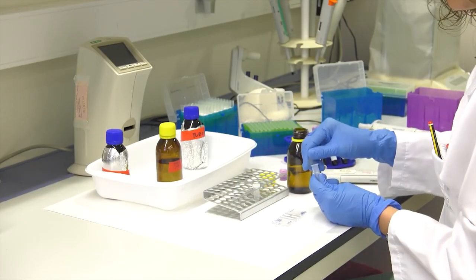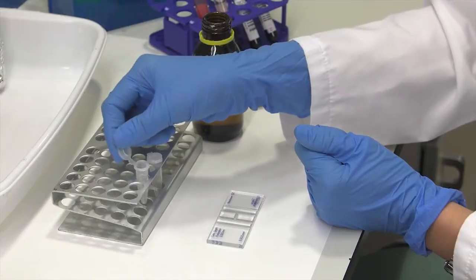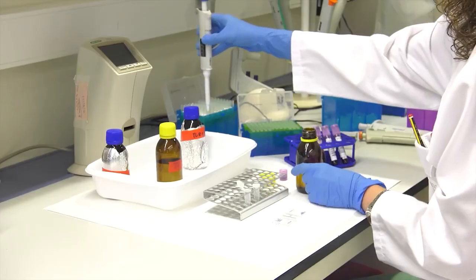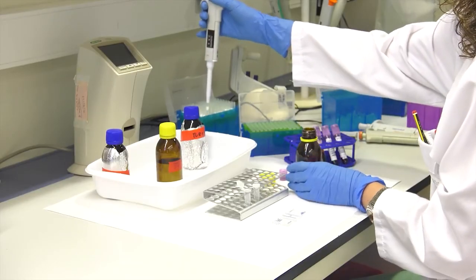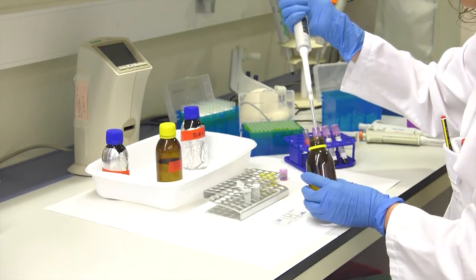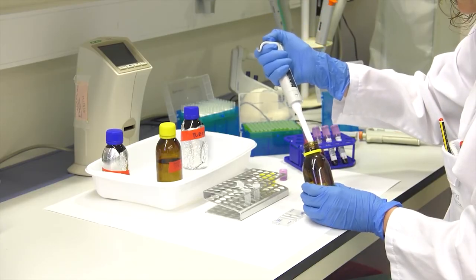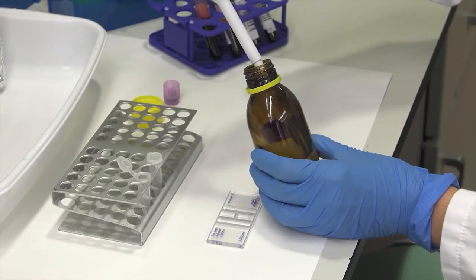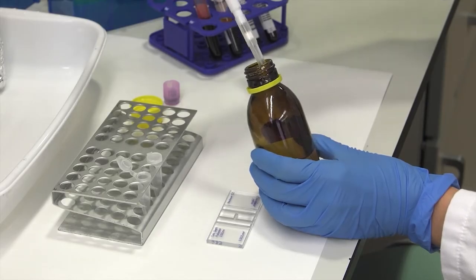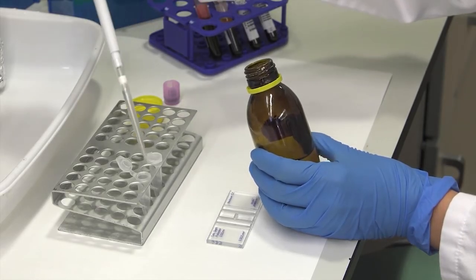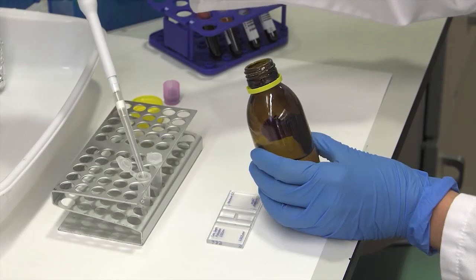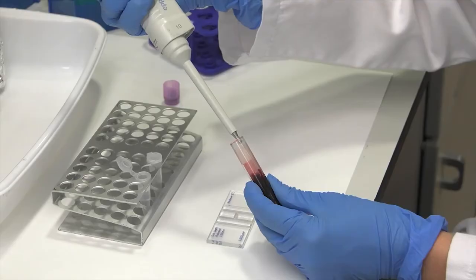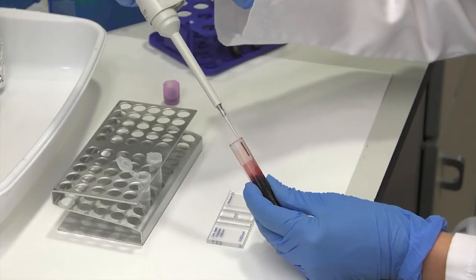To do this, we use the DACIE reagent, an isotonic liquid that prevents cell lysis and contains formaldehyde as a cell fixative and sodium citrate as anticoagulant. In a clean tube, make a 1 to 200 dilution by adding 995 microliters of DACIE reagent and 5 microliters of blood, mixing again gently to homogenize.